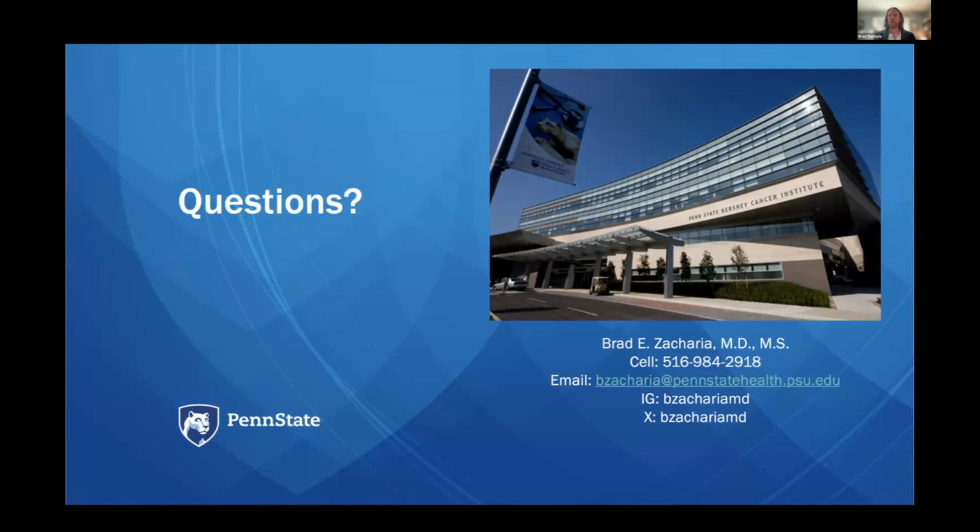The image acquisition and the actual laser fibering is not very long, probably anywhere from 30 minutes to an hour. The placement's probably about 30 minutes to an hour. So it can be a short procedure. When you add in the transport and moving the patient onto different beds, it does make it a longer procedure, but it's relatively limited OR use time. And so I think it can be quite cost effective. And when you bring in the fact that these are patients who either wouldn't have had surgery before or may have had a more prolonged hospital stay, it can be quite cost effective.